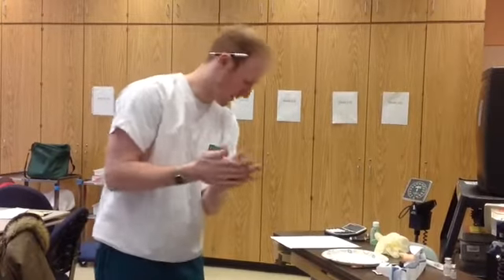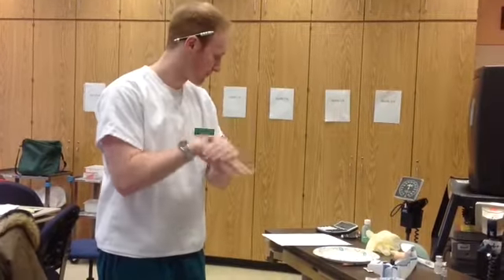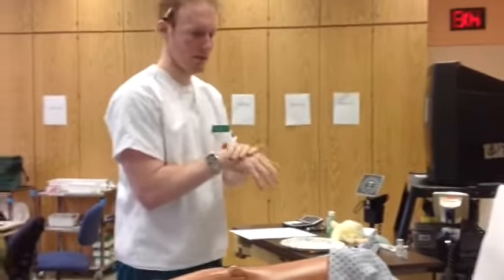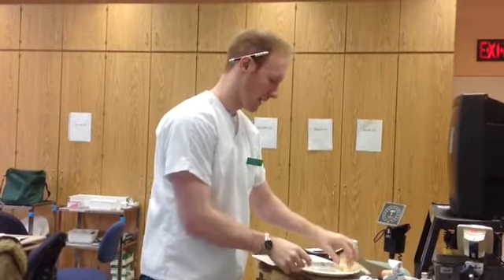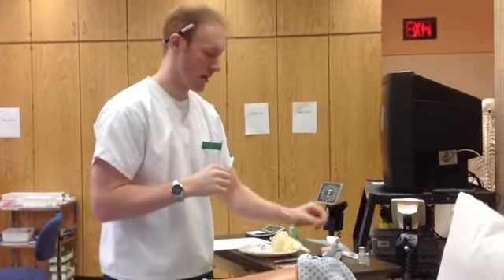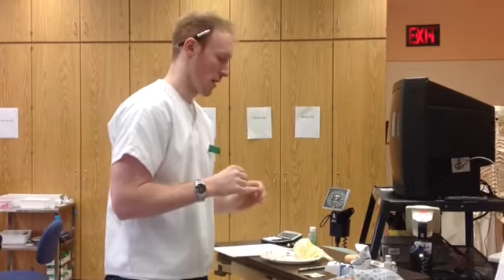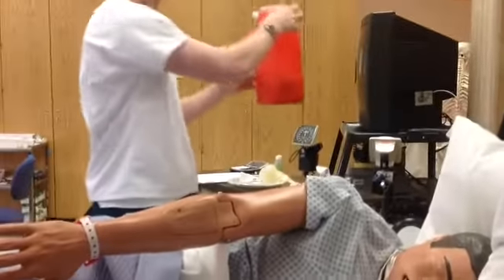And I'm going to gather my supplies with my MAR that has his orders. So I'm going to grab a set of gloves. I'm going to put this onto my plate that I need. I'm also going to grab an alcohol wipe for my patient. I'm going to grab an alcohol wipe for my medication. And I'm going to grab gauze for my patient as well. I'm also going to grab a biohazard bin, which should be in his room.